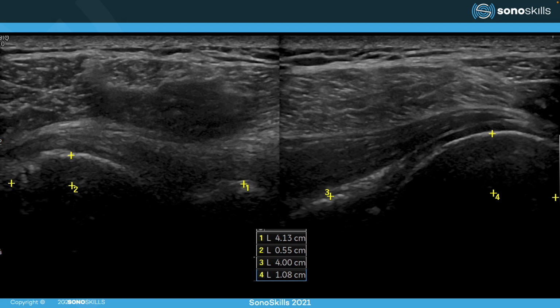And here you can see an example of a misalignment of the glenohumeral joints. We can see a high difference between the right side and also the left side. This is a dorsally luxated glenohumeral joint. You can see it because of this high difference left to right.